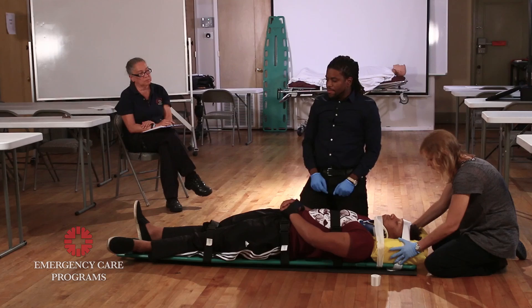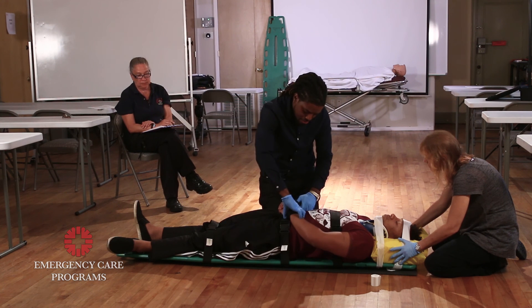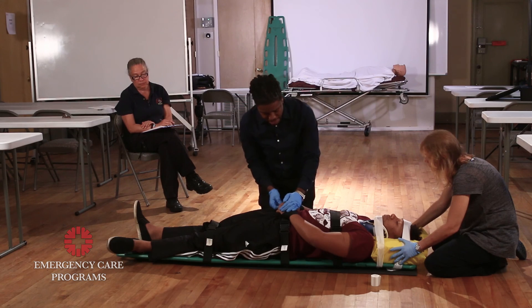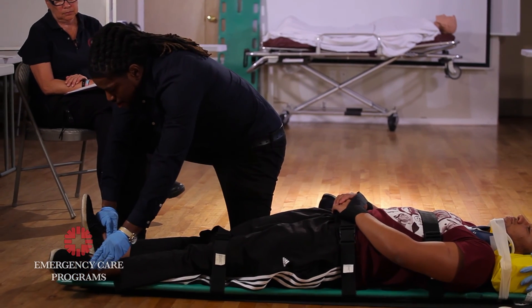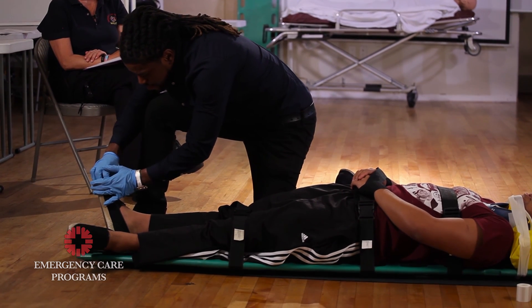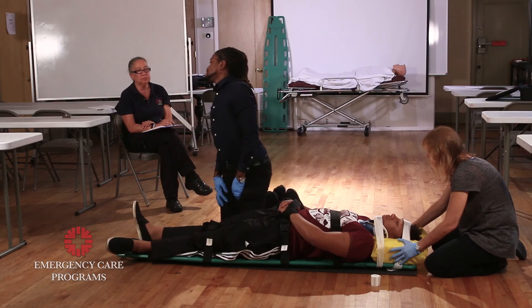Now to make sure nothing's been compromised, I'm going to check PMS. Wiggle your fingers. What finger am I touching? What finger am I touching? Wiggle your toes for me, please. What toe am I touching? What toe am I touching? And we will rapidly transport them.